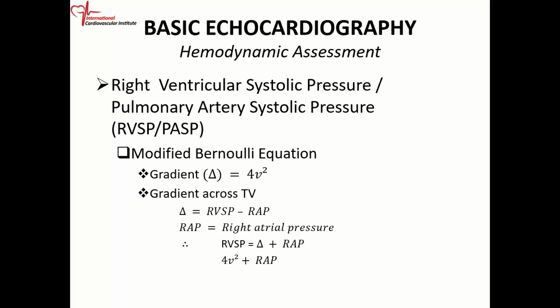And the RV systolic pressure is the same thing as the pulmonary artery systolic pressure, if you don't have an obstruction at the right ventricular outflow tract.